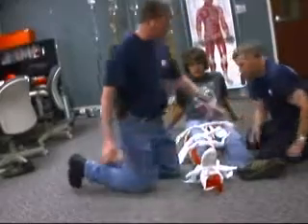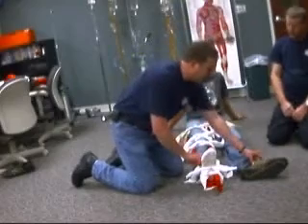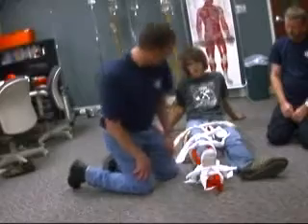If I had time, I might secure both legs together to give some more stabilization. At this time, I'm going to recheck my assessment of the pulses. Can you feel this? Can you move it? Yes. Alright.